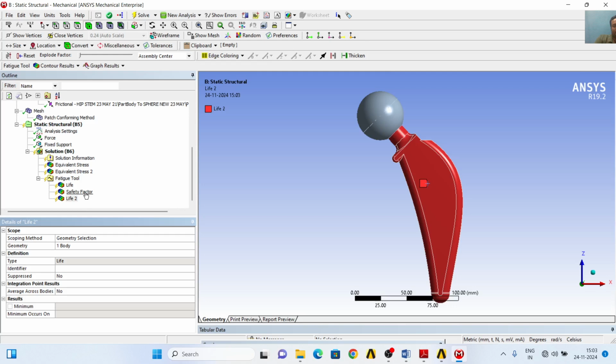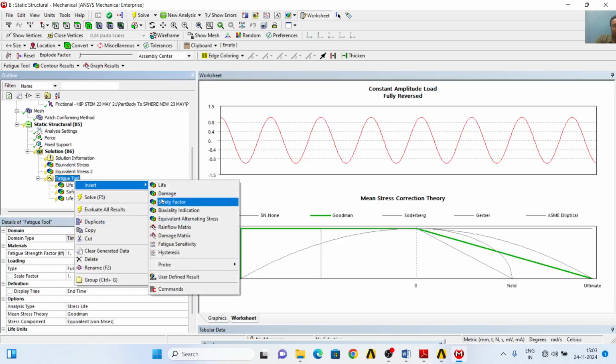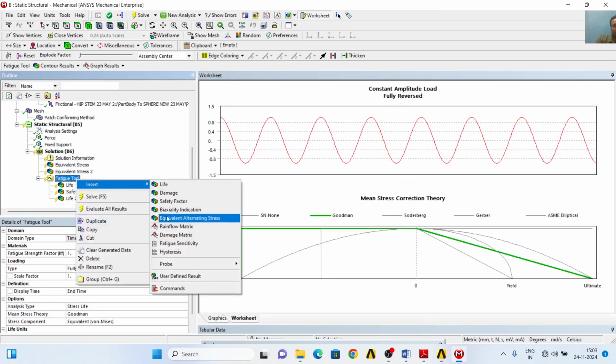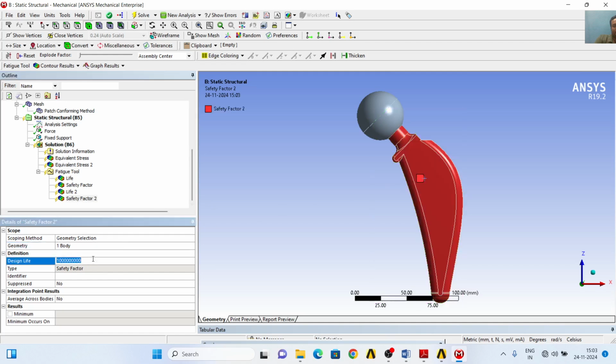Okay, and I will create safety factor for this body and another life 2. Sorry, safety factor 2, delete, yes, insert safety factor 2 for this body, apply for 1e+07 life cycles, that is 10 to the power 7 life cycles I will investigate.